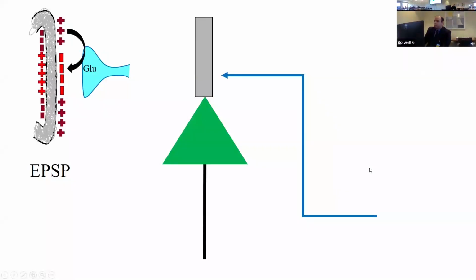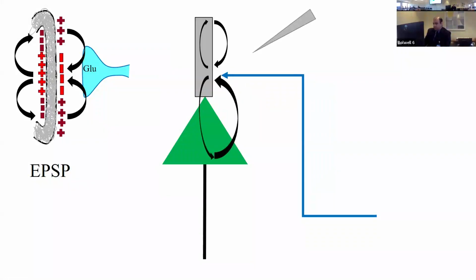All right, so again, going back to how these transmembrane electrical currents will give rise to an extracellular field potential here. Take this example here. As I was saying, when an electrode is placed superficially towards the superficial layers of the cortex, it looks like the current is going away from the electrode, which by convention is called a sink, and will be negative in polarity, and the electrode deeper will be positive. Now, obviously, you don't have that unless you have a depth electrode inside the brain, which you guys don't want to do. But this is just to explain how an electrical dipole is created in the extracellular field, which gives rise to the EEG.